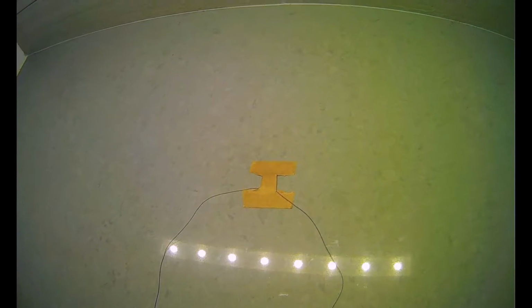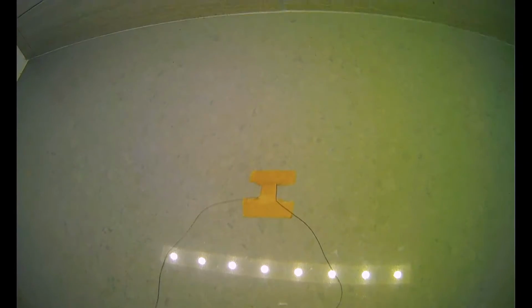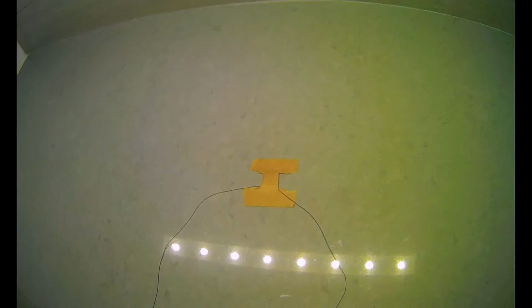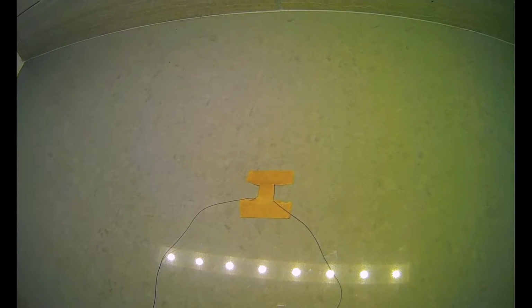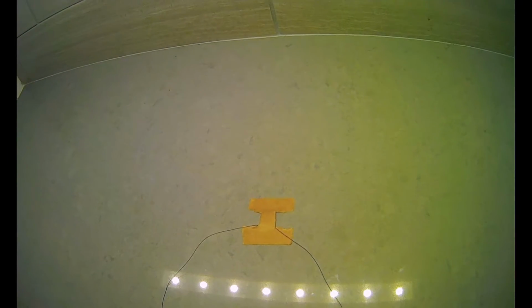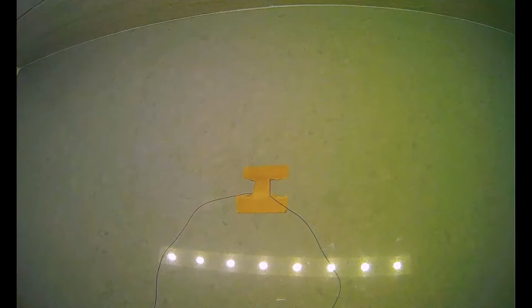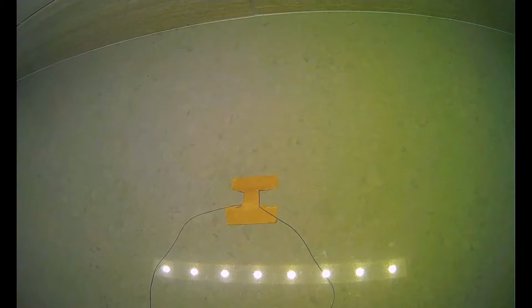Okay, our next step here, now that we know how to instrument tie, is to take that same principle and be able to do it without the needle driver instrument. Now, we may at this point ask ourselves, why do we have to do it without the needle driver? You may feel pretty comfortable now handling your needle driver, and you'll notice that actually the instrument tying with the needle driver uses up less suture and can sometimes be faster because you had the needle driver in your hand anyway. Why would you ever put it down in order to use your hands?